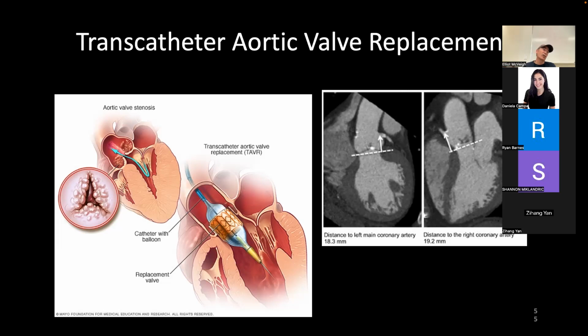And this caused a little bit of friction sometimes, because sometimes they didn't match 100%. So there was a learning curve on that one. But now, I think it's been 5 years people have been doing this, the company, say Medtronic, would provide that analysis for you if you wanted to get it done.